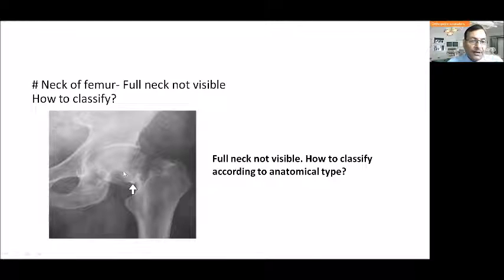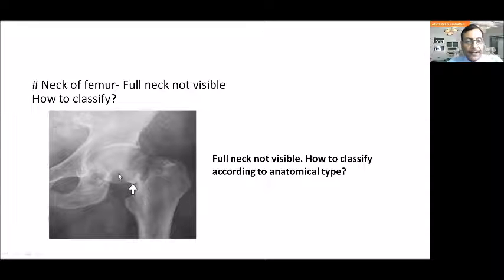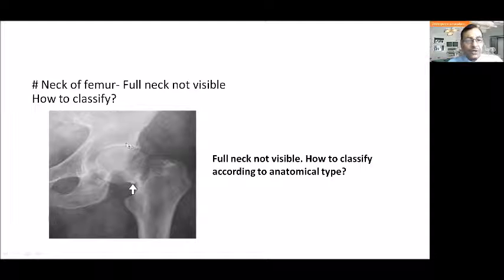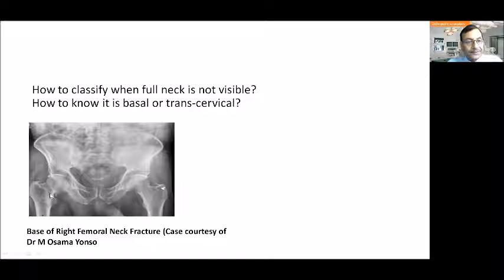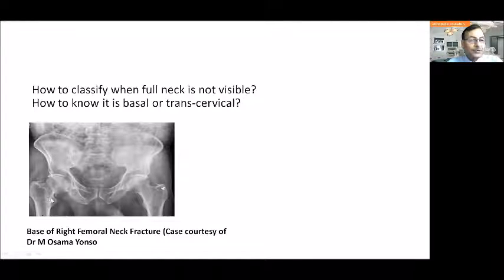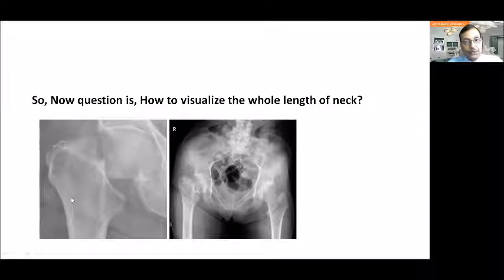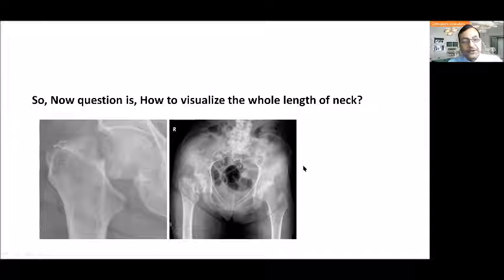Sometimes we cannot determine whether the fracture is transcervical or basal because the full length of the neck is not visible in the X-ray. When the neck is not visible in its full length, anatomical classification is not possible. We need an X-ray where the neck of the femur is fully visualized in its whole length.